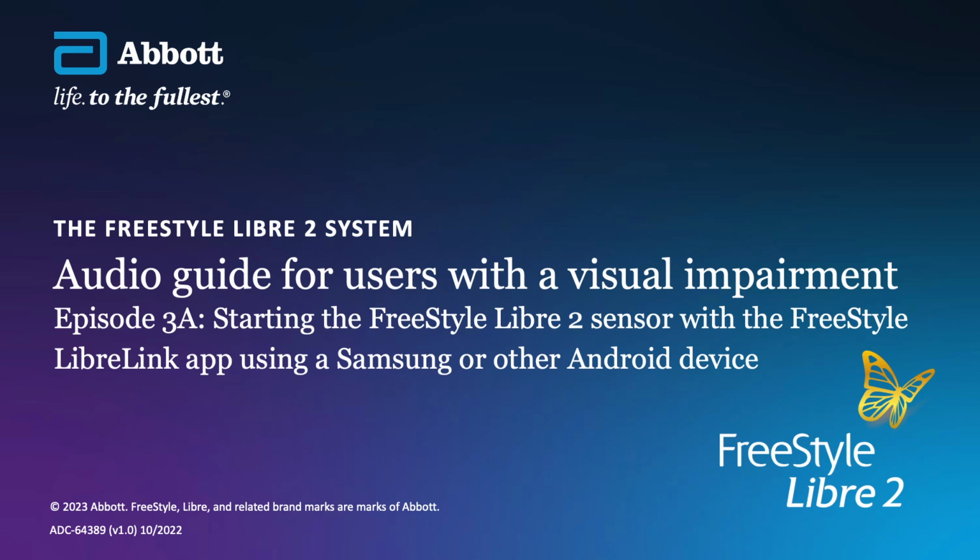You will need a LibreView account to use the app. There will be 2 options at the bottom of the screen. Already have a LibreView account? Sign in and Get Started Now. Assuming you don't already have an account, select the Get Started Now button.